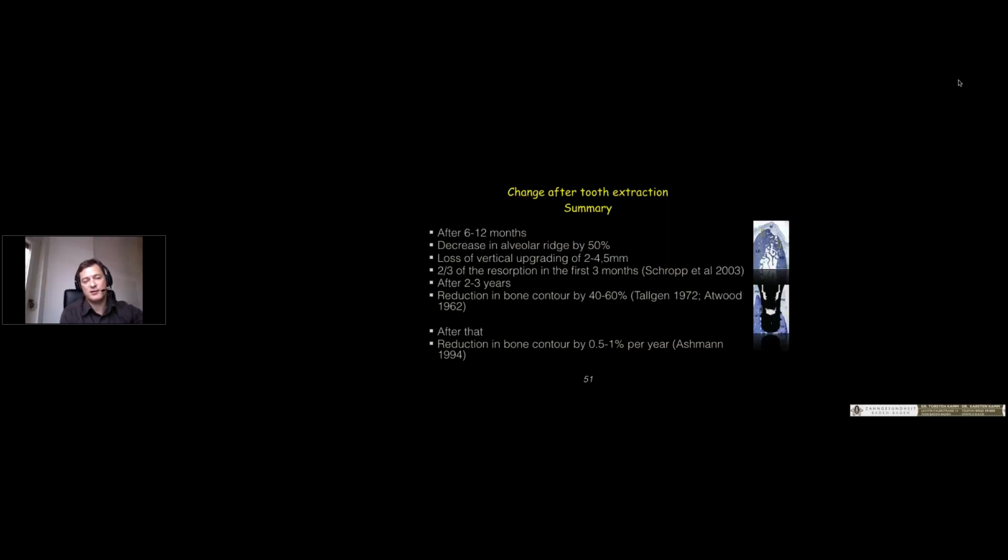If you make these new techniques I showed you before, we do not have this kind of bone loss. You see in my cases, not so much bone loss. We're always losing a little bone with all techniques. It's not possible to make an extraction losing nothing, but you're losing only a little bit. Most people didn't see 1 millimeter. It's not possible for the patient to see it.